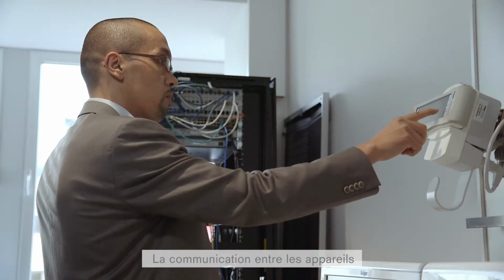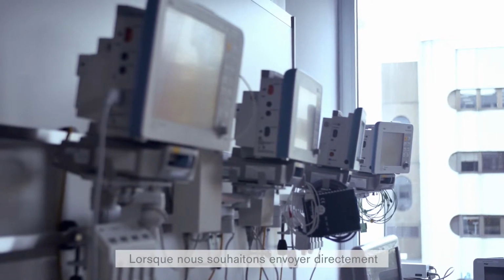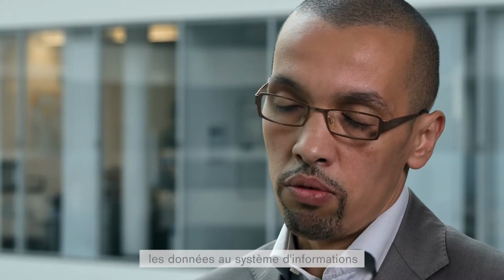Currently, for the communication between Draeger devices, we use a standard communication protocol, a serial communication between devices. We collect information such as waveforms, alarms, trends, and the settings coming from our ventilator, such as the Evita V500. When we need to communicate that information to our clinical information system, we use our Draeger Infinity network. When we look at sending the information directly to the information system, which is on the server, we use a proprietary protocol, which is the Draeger Infinity network.